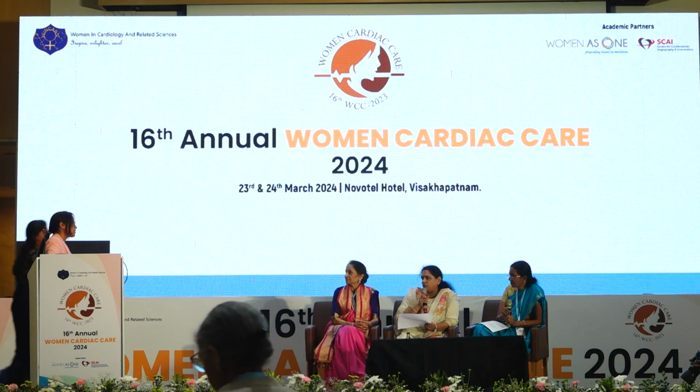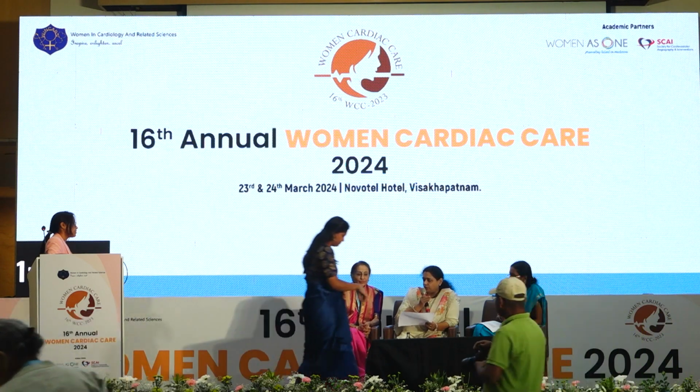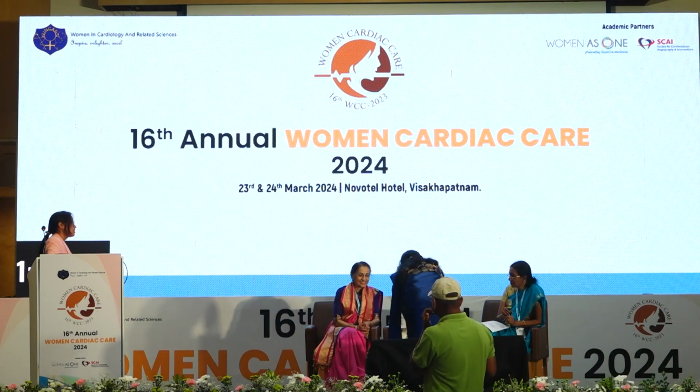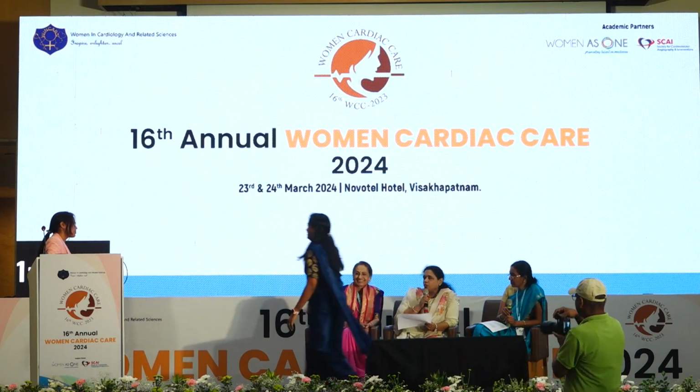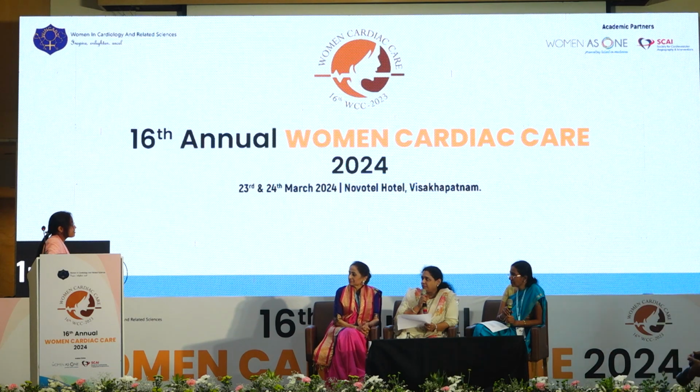Very good. And what atmospheres did you dilate the drug-eluting balloon? Here you have put 16, 12. Normally, how much do you go for a drug-eluting balloon for the medicine to be fully deployed? Ma'am, it may be 16 or 20 atmospheric pressure. No, even more than that. For how many seconds do you go? Approximately 30 seconds. And there are studies showing we can even go up to 60 seconds in certain conditions. Kindly get updated with that.